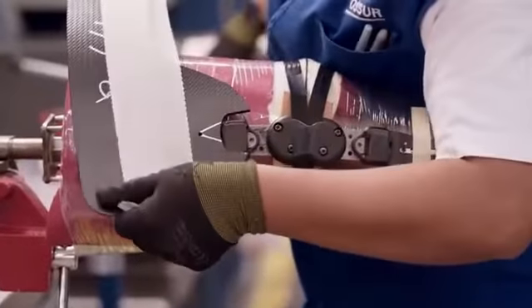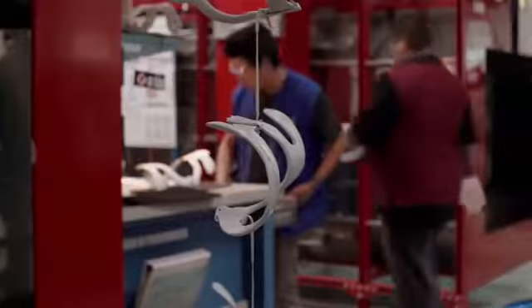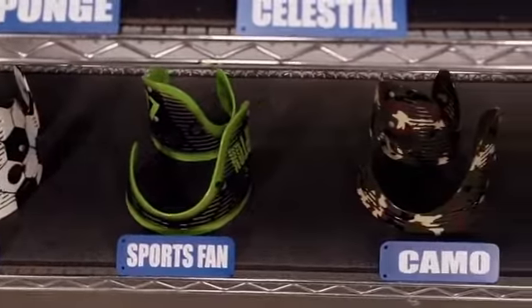Most importantly, the hinge arms and cuffs are contoured to follow the exact shape of the leg model, providing a truly custom fit. Once the brace frame is complete, it's ready for paint. Ossur's in-house artists offer custom paint options that are second to none — the only limit is your imagination.